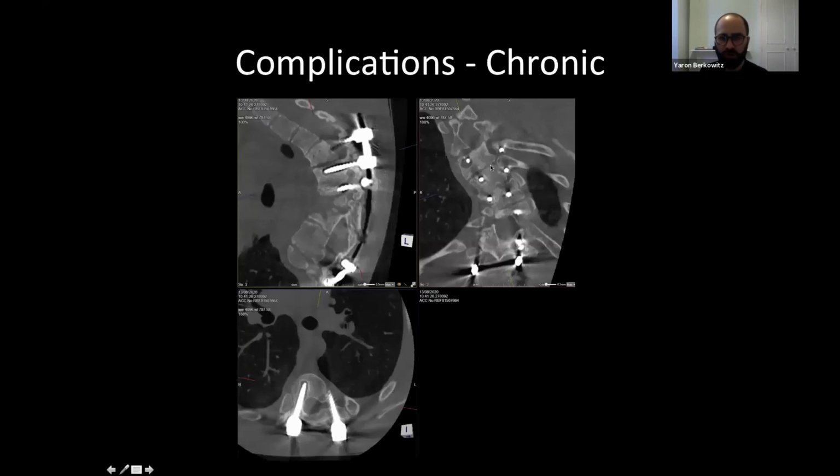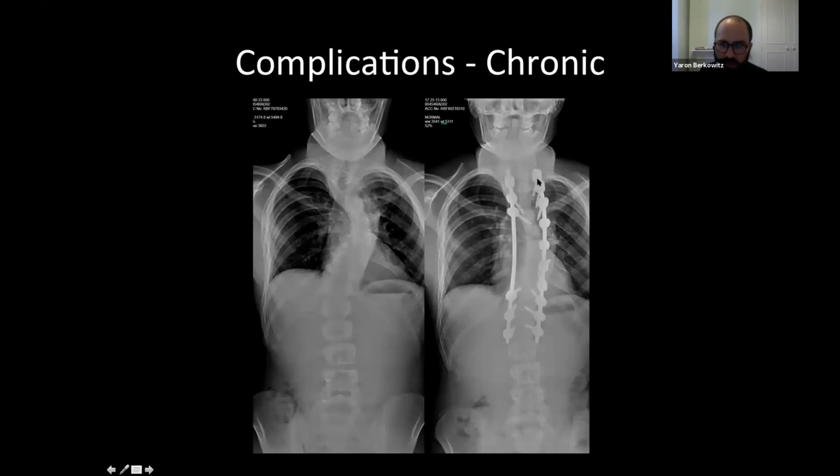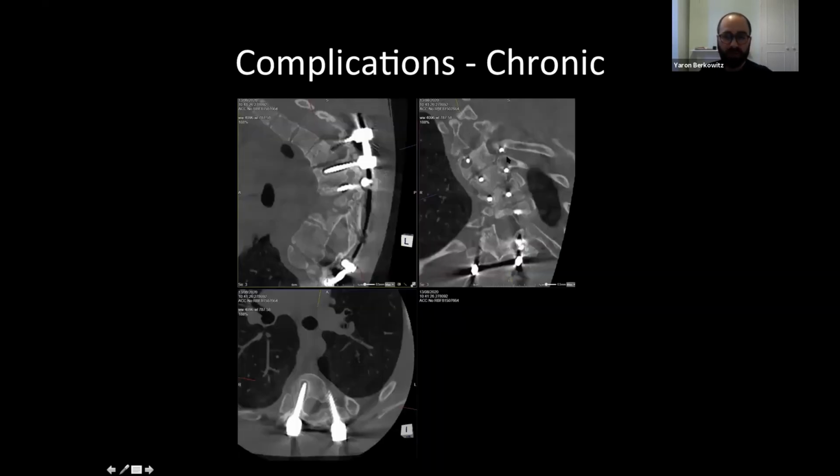Now, if we first look at the coronal imaging, those upper two screws are a little bit lateral. So you can see they're not pointing inwards at the vertebral bodies. And it's hard in scoliosis because there's a rotational element to the deformity. So often they'll have to change the direction of the screws because the patient's got such a significant rotoscoliosis, rotational component. And as a result of these screws not providing much fixation strength, there's loosening of the upper screws.